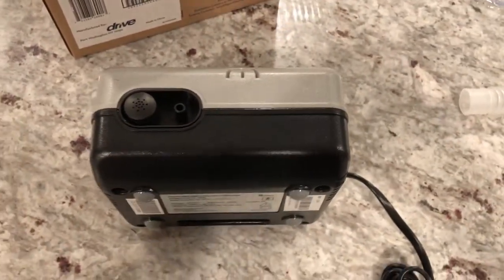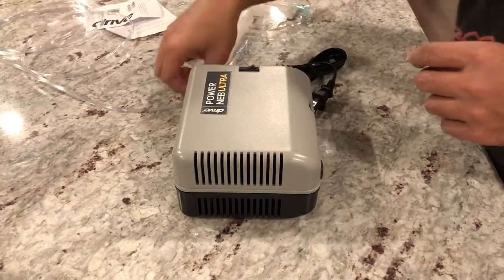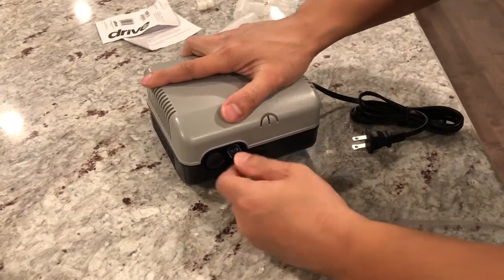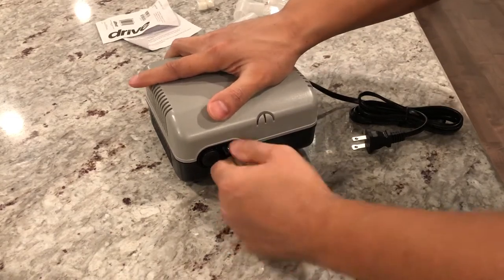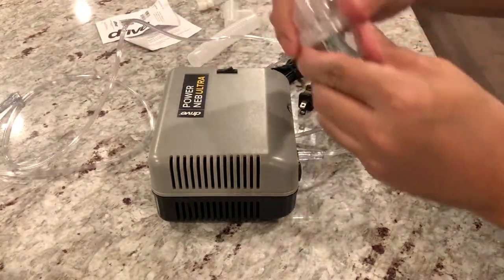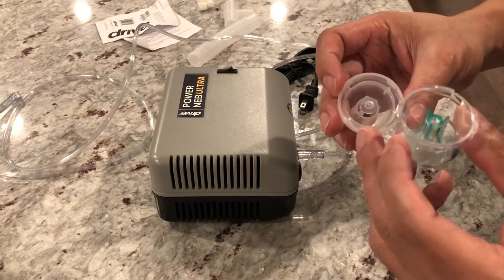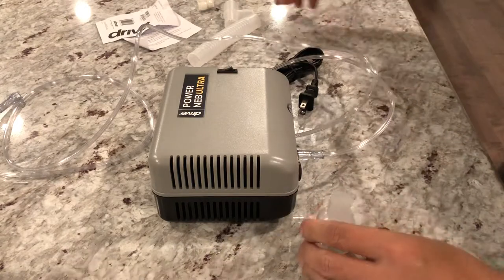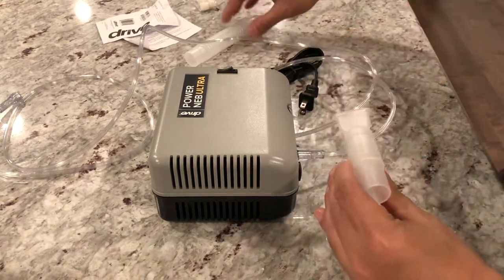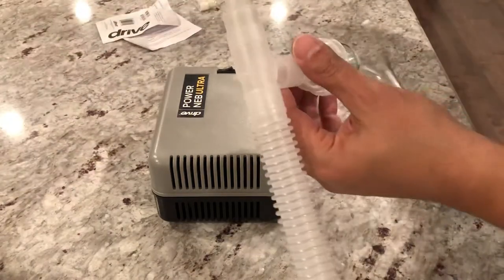Now I'm going to put this one back — it just pops in — make sure it's nice and snug. Put the filter back, put that back there, and take this tube and connect it to this port here. Make sure that's nice and snug — it's actually pretty tough to put in. On this side we have our medicine cup, and this tube goes in here, then the mouthpiece on the other side.